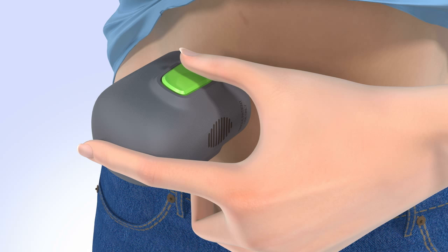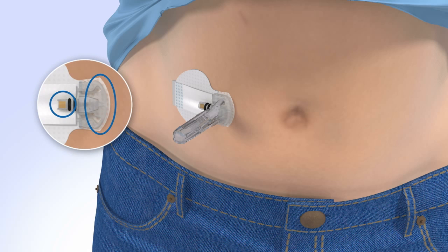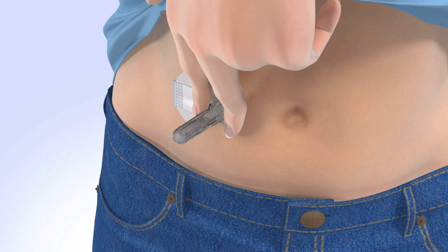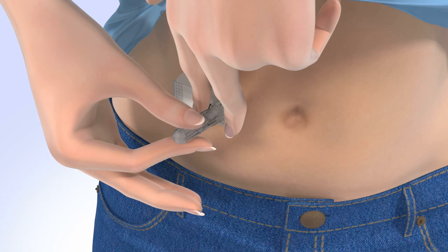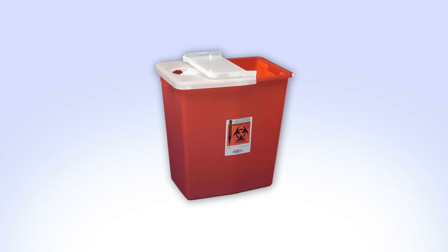Do not pull the serter away from your skin yet. Continue to hold the serter against your skin to allow time for the adhesive to stick. Then slowly pull the serter away from your skin, making sure you do not press the buttons while doing so. With one hand, gently hold the sensor by placing one finger on the front of the sensor and one finger on the sensor connector to ensure your glucose sensor stays in place. Be sure you do not hold or pinch the sides of the sensor. With the other hand, hold the needle housing at the tip and slowly pull straight out away from the sensor. The needle automatically retracts inside the plastic needle housing. Discard the entire piece into a sharps container.